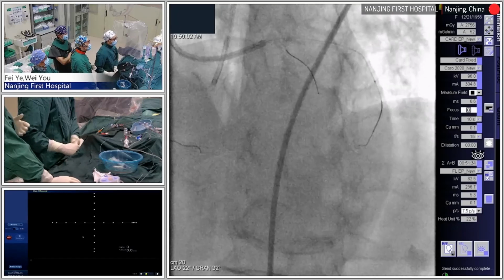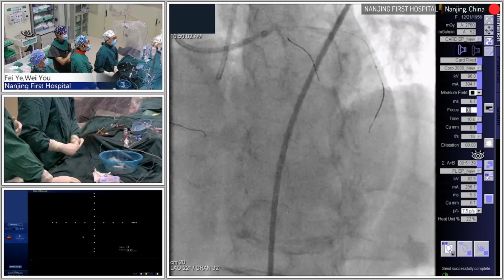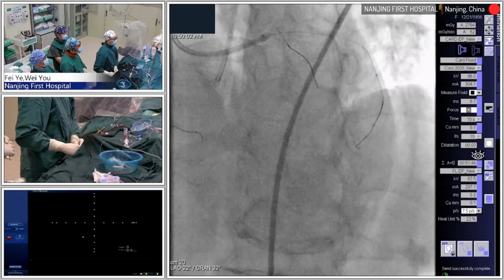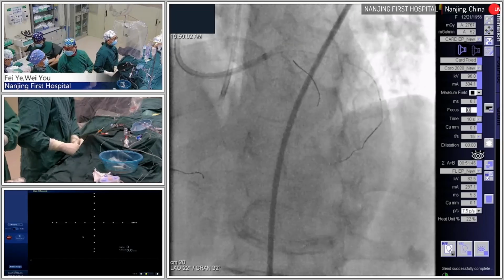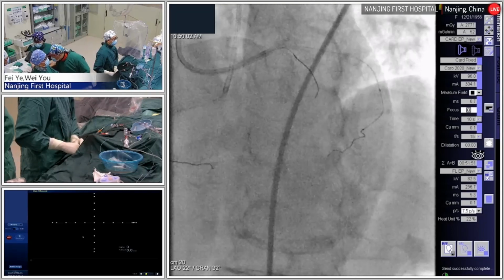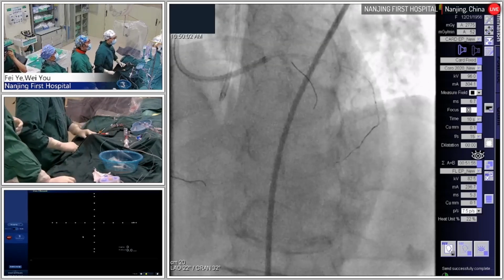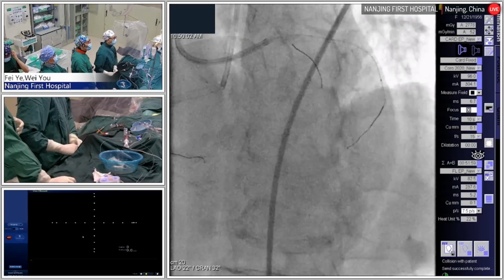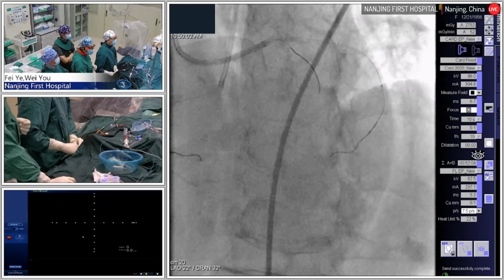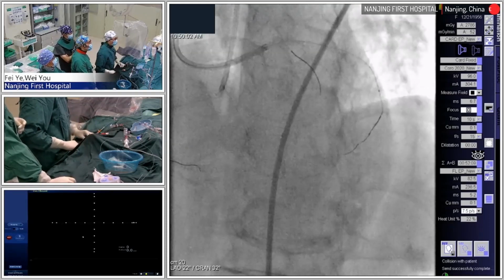The same channel. For the original, here you can find another branch. A bit more.